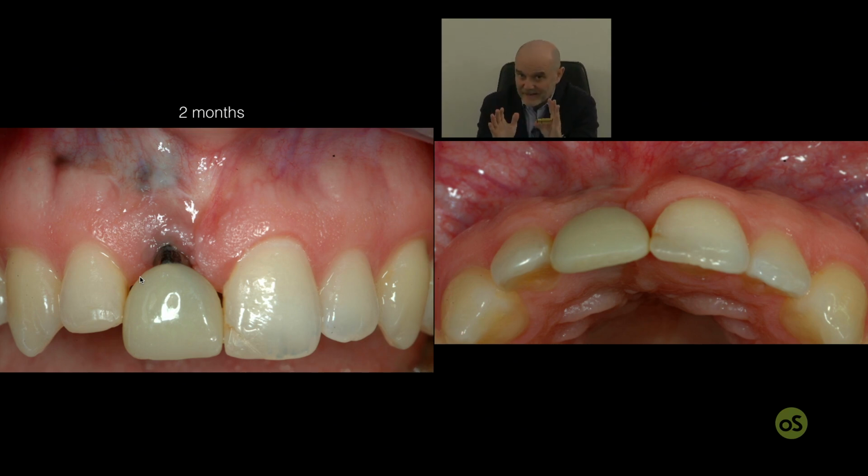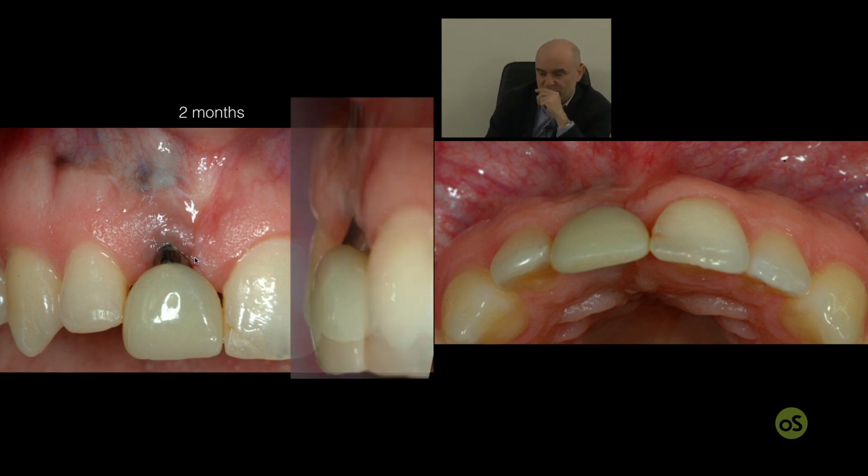And until you see that this connective tissue is completely attached, not attached in terms, obviously, of attachment, but very, very tight against your very, very narrow abutment, you don't have to schedule your surgical procedure. Because the more you gain in terms of quality, the more predictable is the success of your surgical procedure.